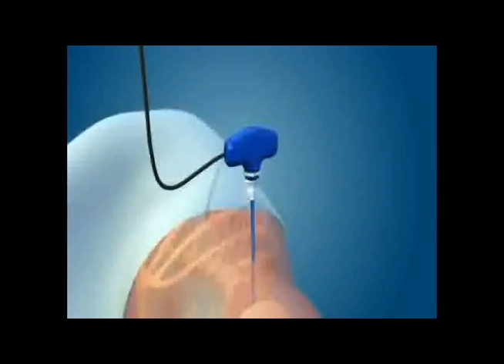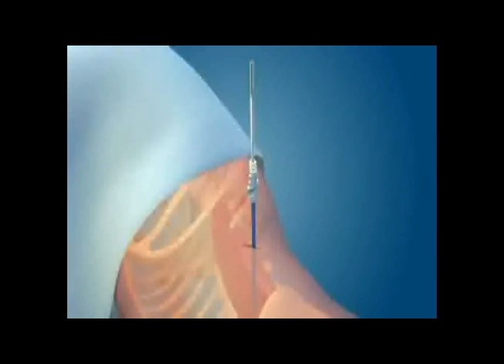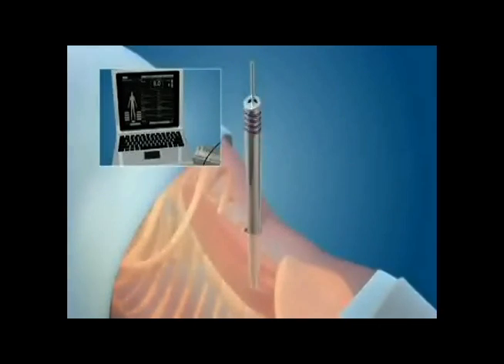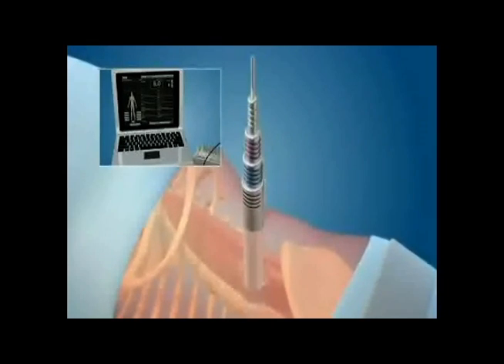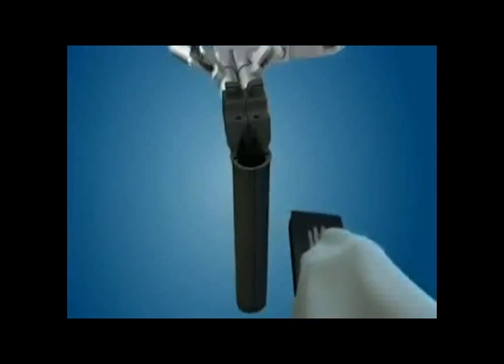An access probe is inserted through the psoas muscle using spinal monitoring to avoid injuring any nerves. Once the probe is in place, a guide wire is inserted and the tissue is gently dilated to retract the muscles out of the way.